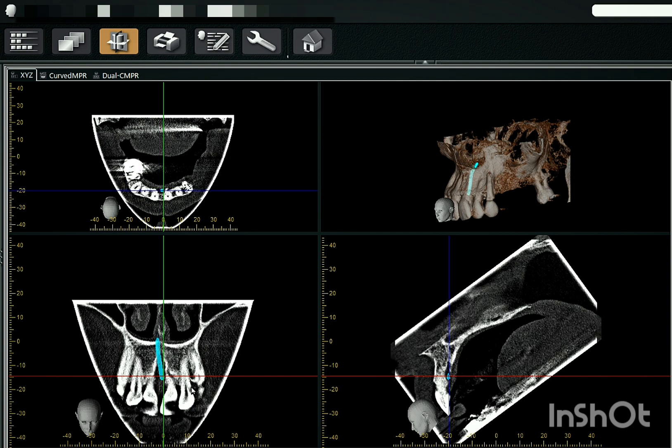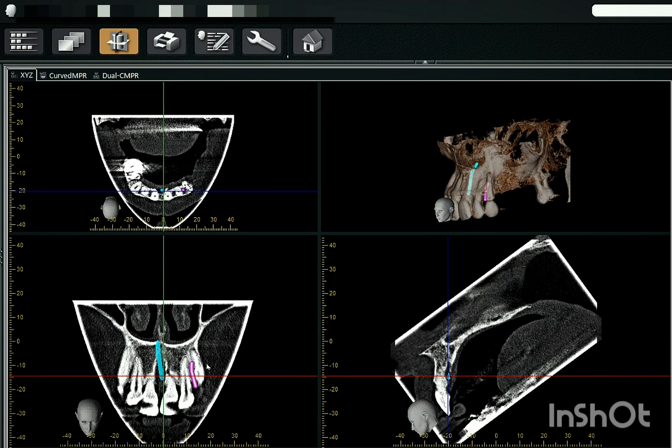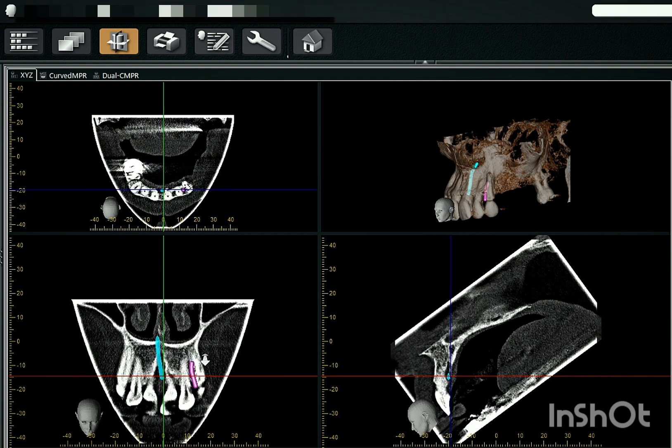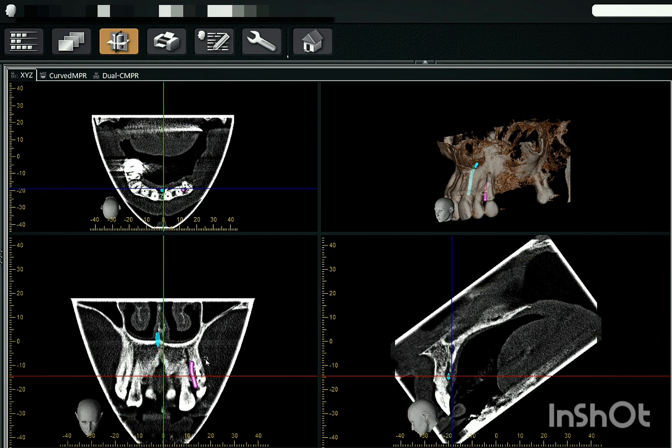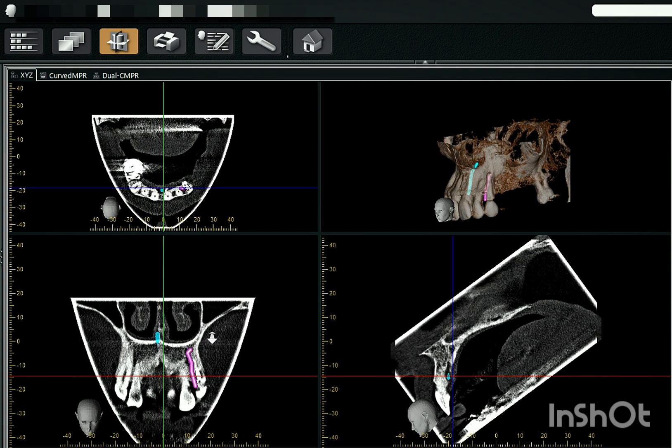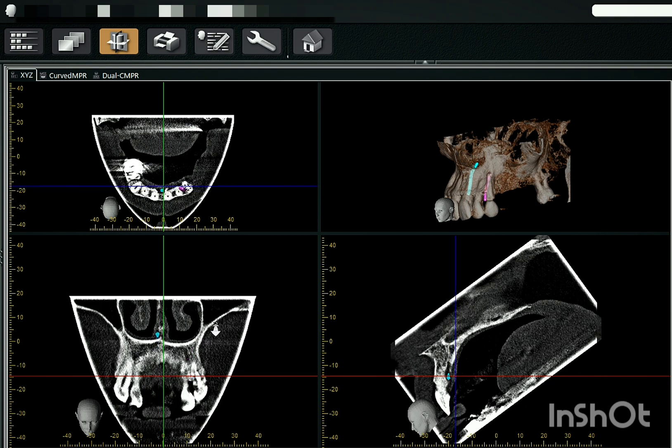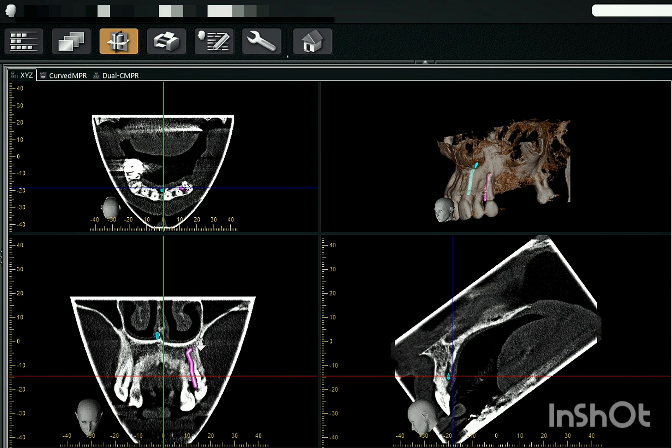So you can just keep it to normal sharpness and now start tracing it. So somewhere between the incisor and the canine region, and then it goes up, then in between the nasal palate and nasal flow and the premaxilla region between and it ends somewhere near the sinus region.